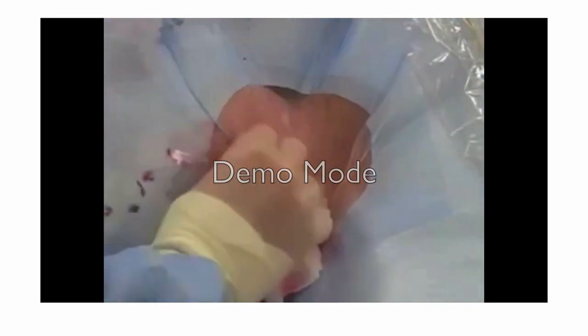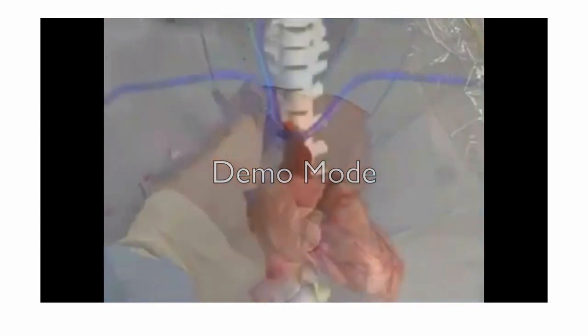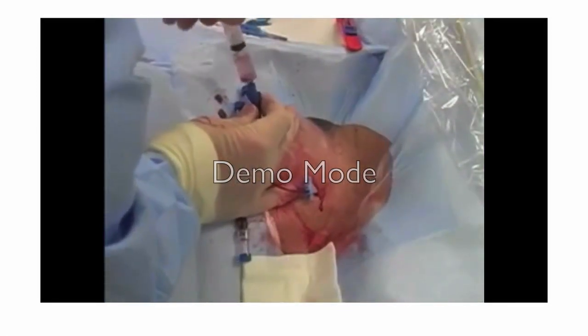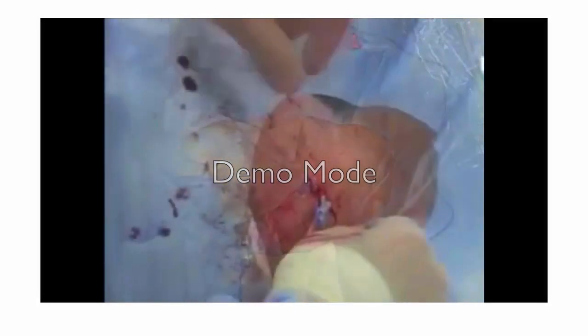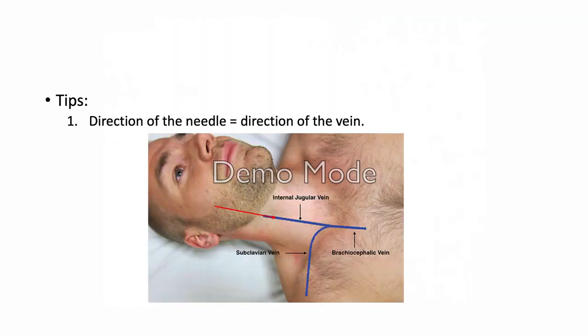And from now, the steps will be easier for you because the line is in. There are 3 things you need to do. One is to flush your catheter, and check the inflow and the backflow. Close it with the blue caps, suture it, and then apply the dressing. Okay.